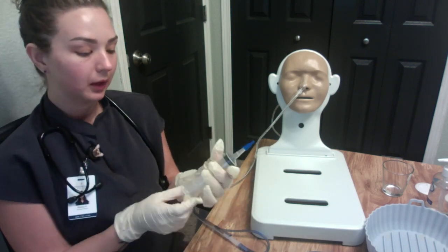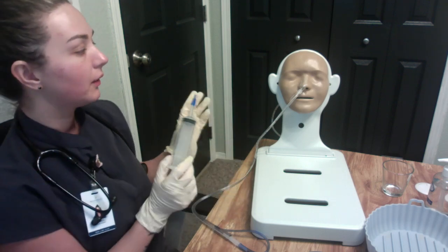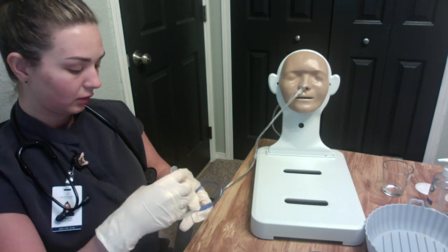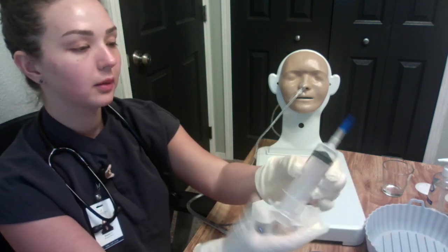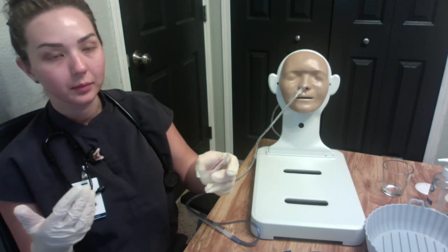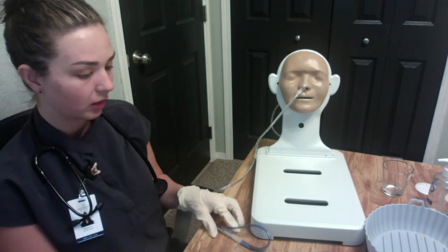Now from here what we're going to do is test the gastric contents and test the pH, and also make sure that we are verifying placement with an x-ray. We're going to twirl it around a little bit, and then put it in our cup for pH testing. We're going to put the pH test in. Depending on the facility, pH is 1 to 5. So it's within range, so we are good there. And then we would have the x-ray team come in and do a verification on placement.